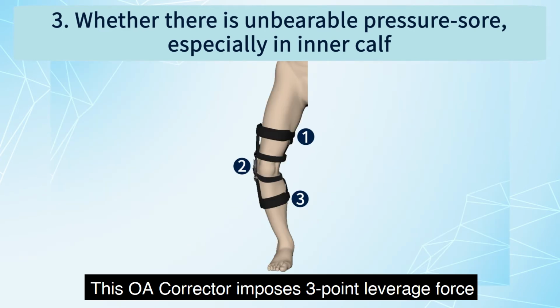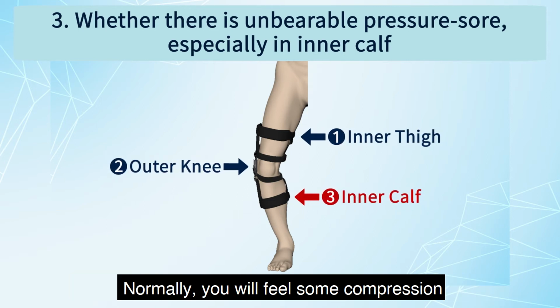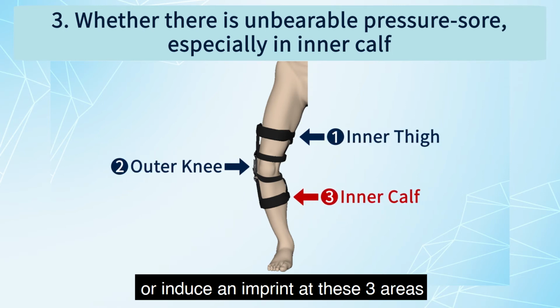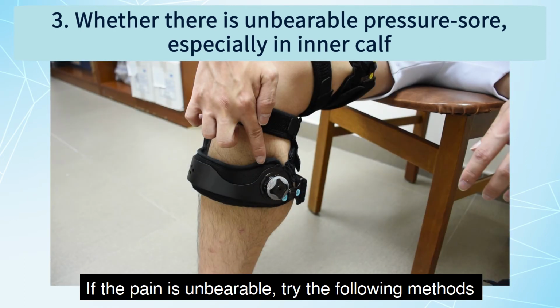This OA corrector imposes 3-point leverage force to correct deformed knee. The 3 points are the inner thigh, outer knee, and inner calf. Normally, you will feel some compression at these 3 points when applying, or induce an imprint at these 3 areas. Especially the inner calf area feels pain. If the pain is unbearable, try the following methods.